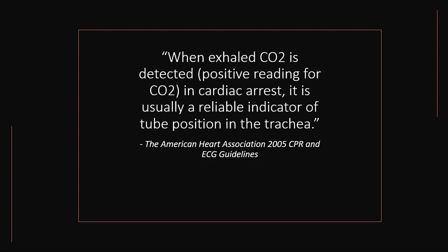Now the number for your end-tidal CO2 may not be where you want it to be. It may be 25, maybe 20, maybe 15. But if there's any CO2 production at all and you're moving any blood at all, you should still get a normal shaped waveform. And that's why the waveform is so important.